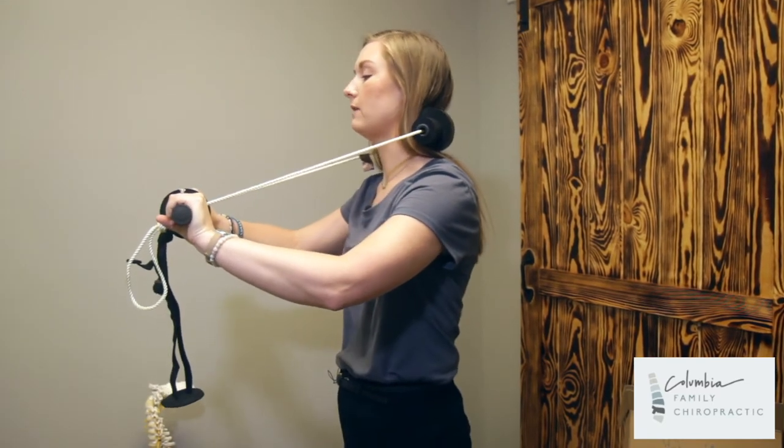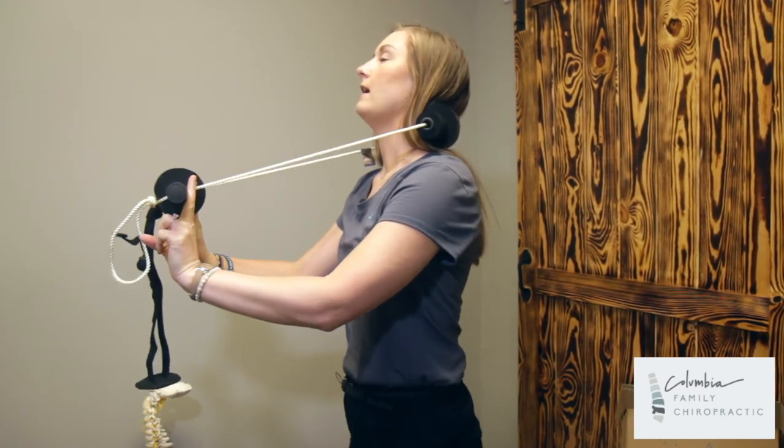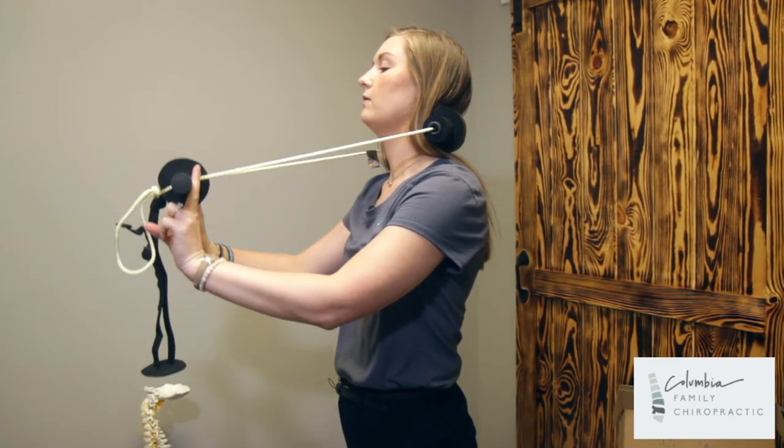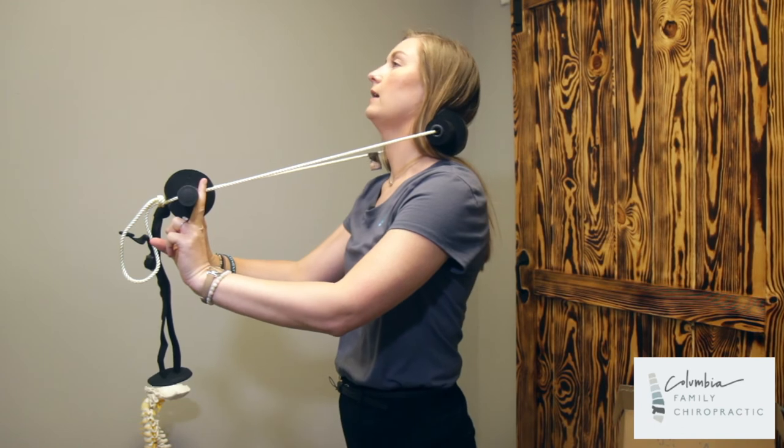You can hold on just like this, but if you feel like you are pulling yourself forward, I want you to just put two fingers up and hold just like this, so your neck will slightly be bent back. I am doing straight on here.